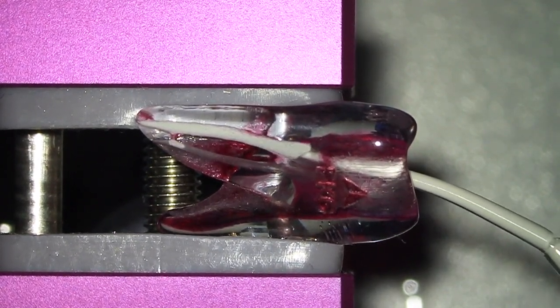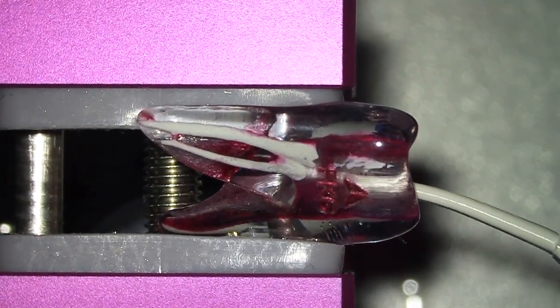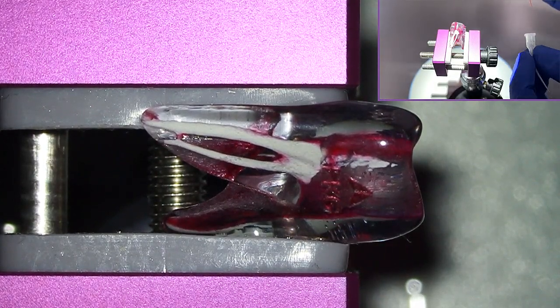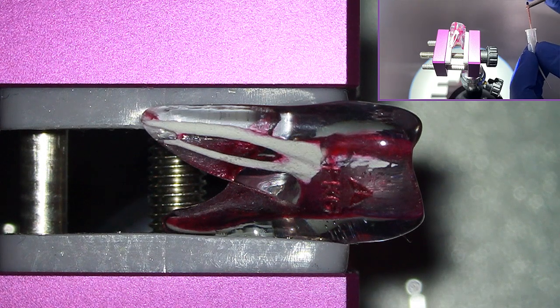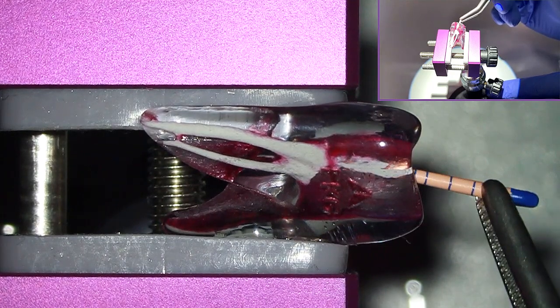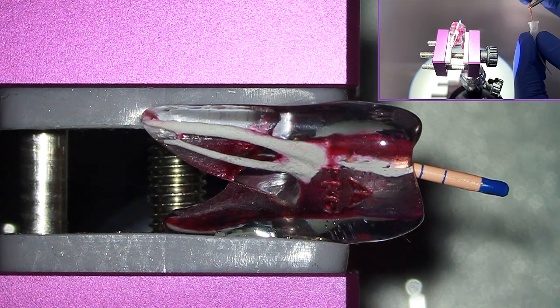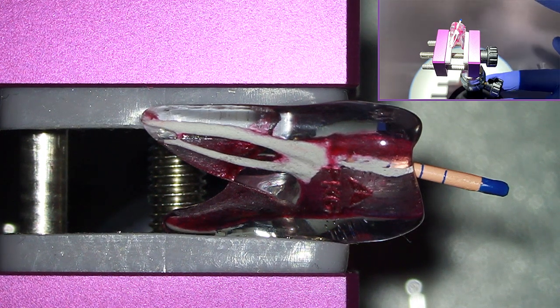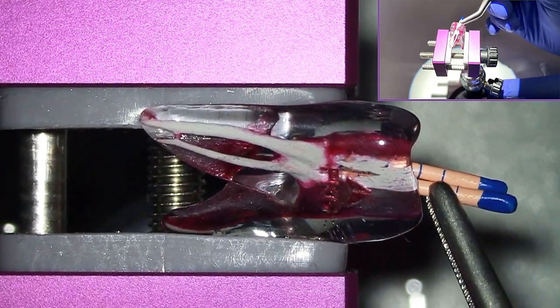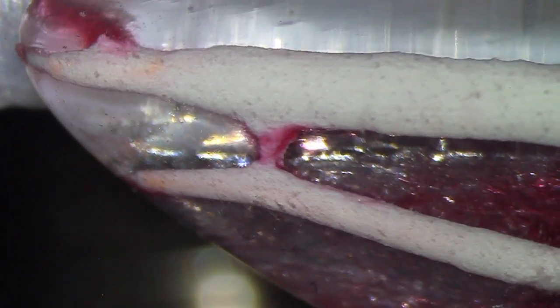Notice that thanks to proper cleaning with the finisher, the sealer goes through the isthmus to the second canal. Before inserting a gutta-percha point into a canal, cover its tip with the sealer to make the obturation adequately dense. The easiest way to do it is to put the gutta-percha point in the tip unscrewed from the bioceramic sealer syringe. Such a gutta-percha point covered with the bioceramic sealer is ready to be placed inside the canal. Notice the tight and dense obturation of the apical part of the root canal system along with the isthmus at high magnification.